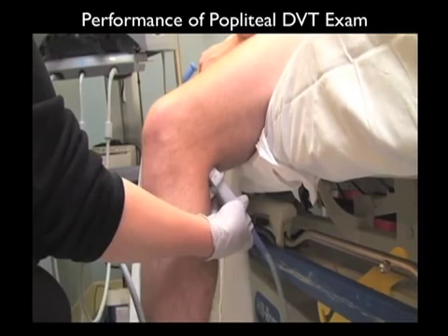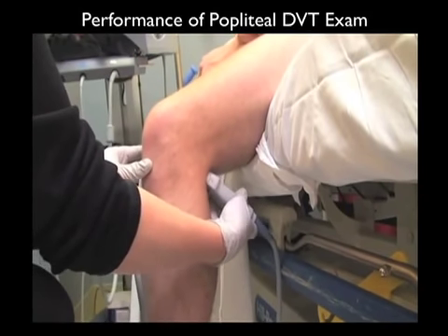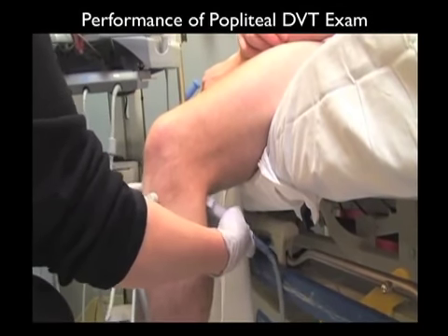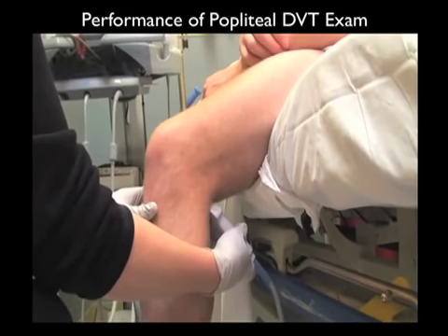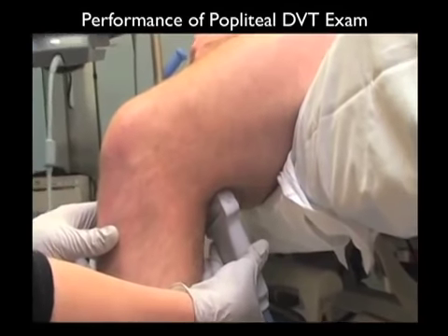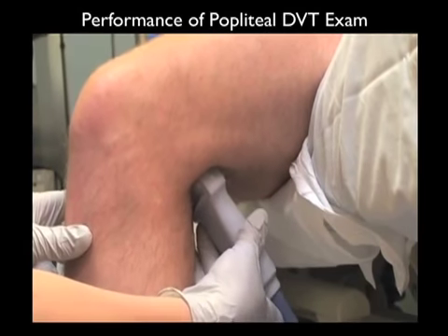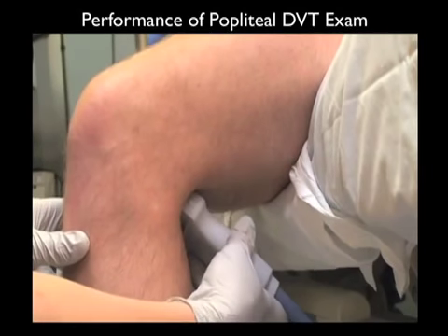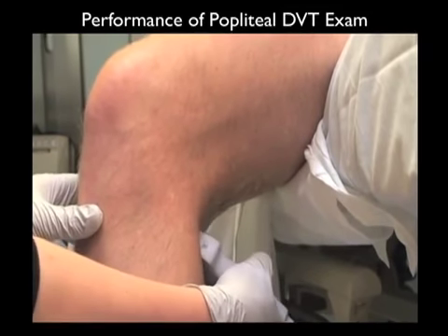It's best to have the patient sitting up to further distend the popliteal vein, and I like to have the patient sitting up with the leg dangling over the bed. I can then pull up a chair and move anterior to the patient. We'll place the high-frequency linear array probe high within the popliteal fossa, sequentially compressing at levels all the way down to trifurcation. Notice that we're using our other hand to stabilize the anterior knee as we press with the probe posteriorly. So again, we'll start high within that popliteal fossa, compressing sequentially all the way through the levels of the popliteal artery and vein, down inferior there, all the way down to trifurcation.